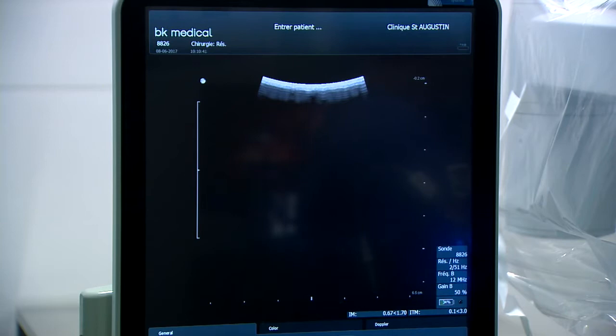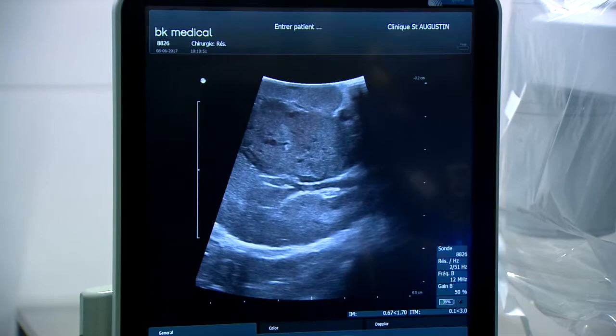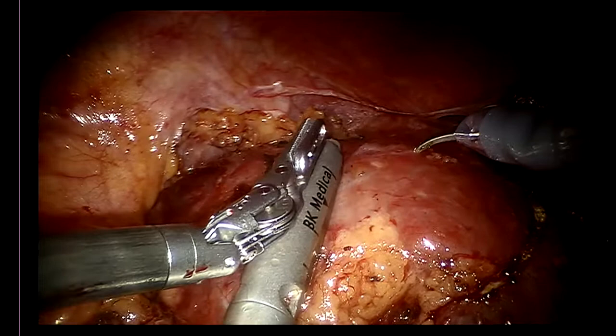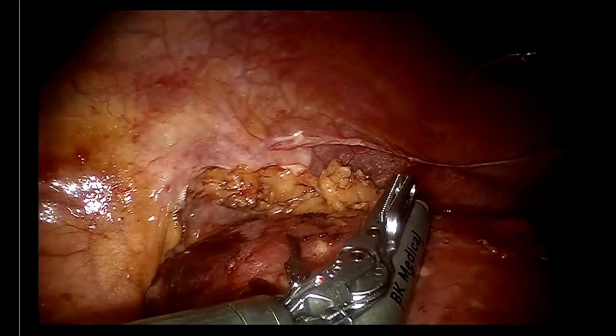Can we have the intraoperative picture, please? Then you can't see the ultrasound, it's one or the other. But how are you scoring? I'll show it to you. Here's the tumor. Tumor, no tumor. So now I'm scoring it where there's no tumor. That's what I wanted to see.